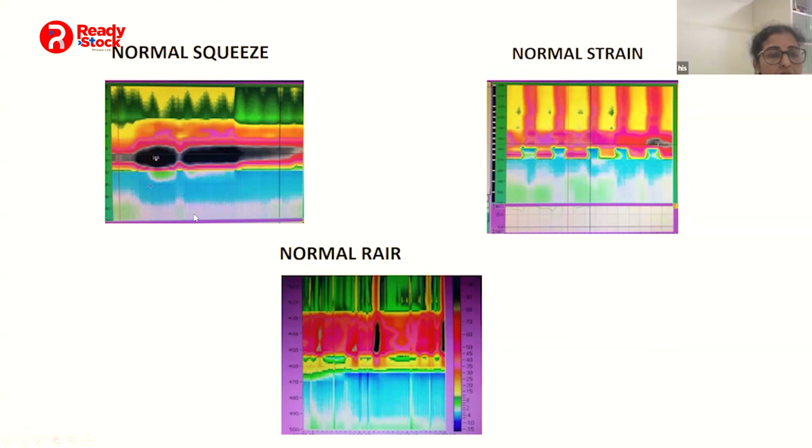If you were to see pink lines at the bottom of the anal sphincter, then it would mean he or she is using the gluteal or the thigh muscles to augment the squeeze, and that should not be considered the true squeeze. What you're looking at above here, the green and yellow, is the area of the rectum, and the band that you see is the anal sphincter.